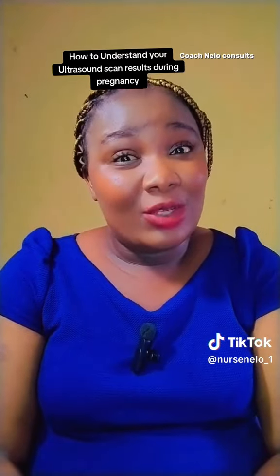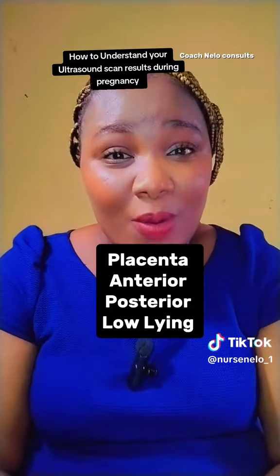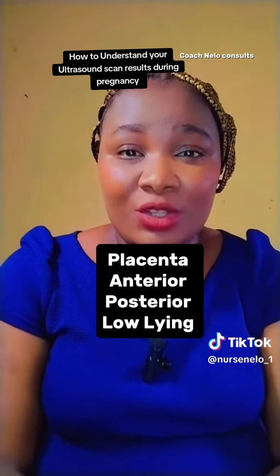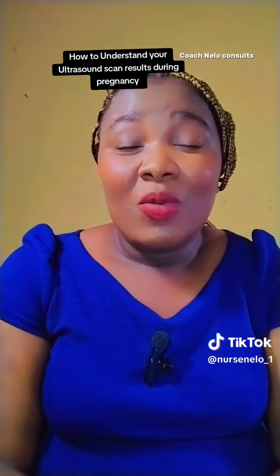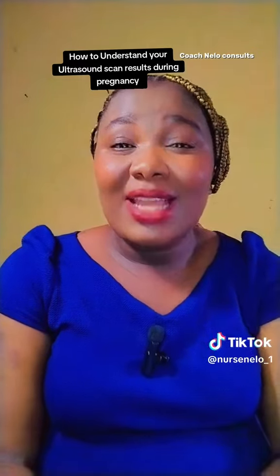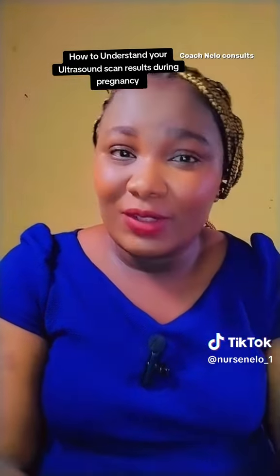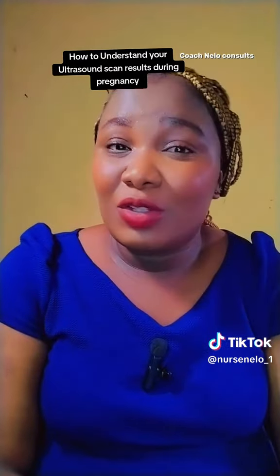Then another one that you see again is placenta. They will either say the placenta is anterior, posterior, or low-lying. When the placenta is anterior, it means it's in front of the uterus. When it is posterior, that means it's at the back of the uterus. Then when it is low-lying, that means it has left the upper segment and is now at the lower segment, very close to the opening of the cervix. And once it covers the cervix, then vaginal delivery is not advised.